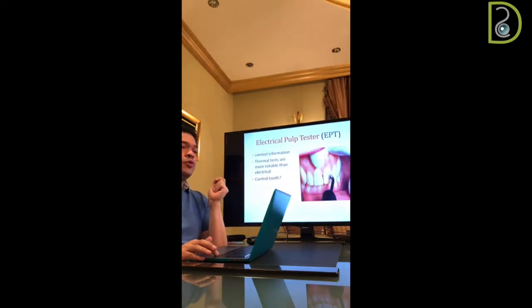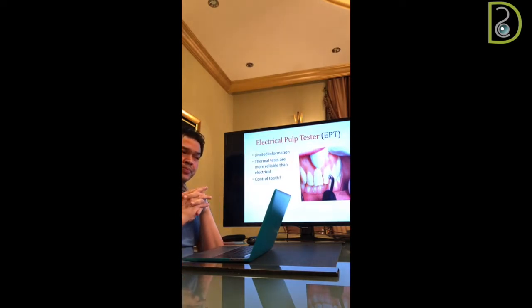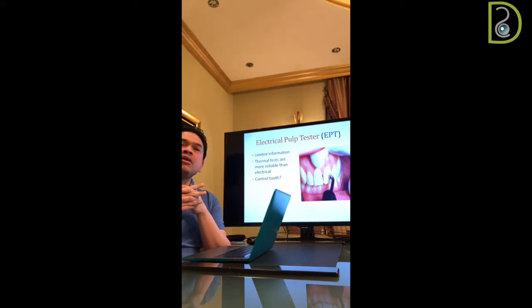The third test is what we call EPT. EPT sometimes gives limited information. Recently, some reviews regarding pulpal and apical tests claim that the cold test is more reliable than the electrical pulp test, and nowadays we depend mainly on the thermal or cold test most of the time.